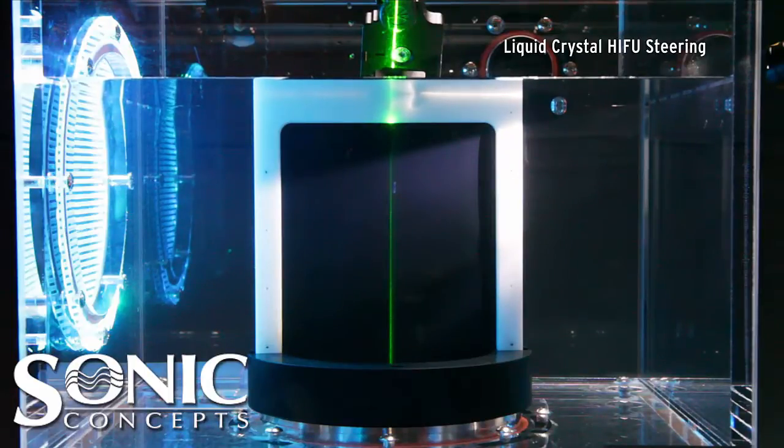A green laser is used to generate a plane of light passing through the central axis. This particular H300 phased array is comprised of 128 elements arranged about the spherical aperture in the form of an Archimedean spiral.